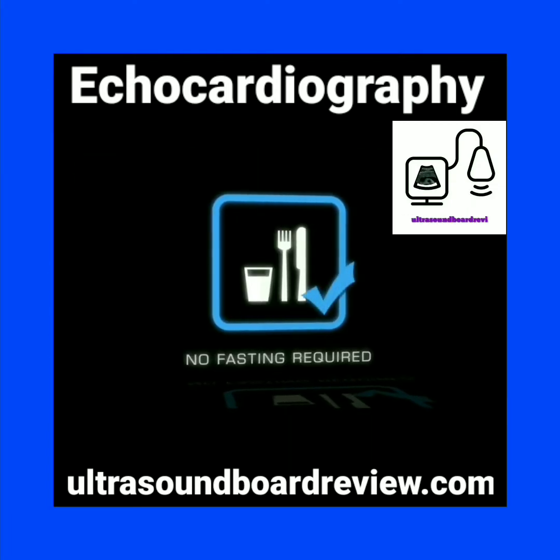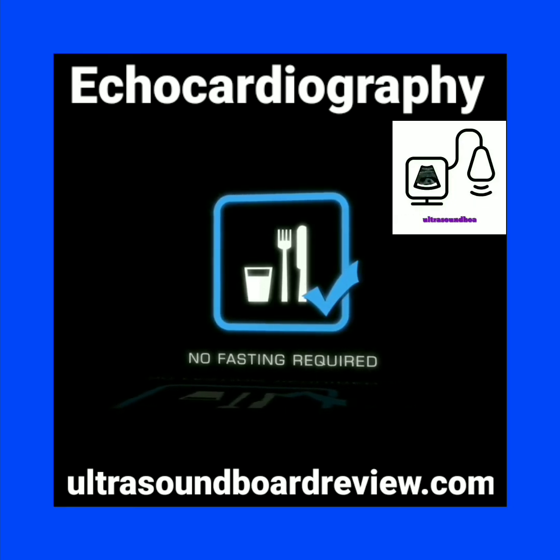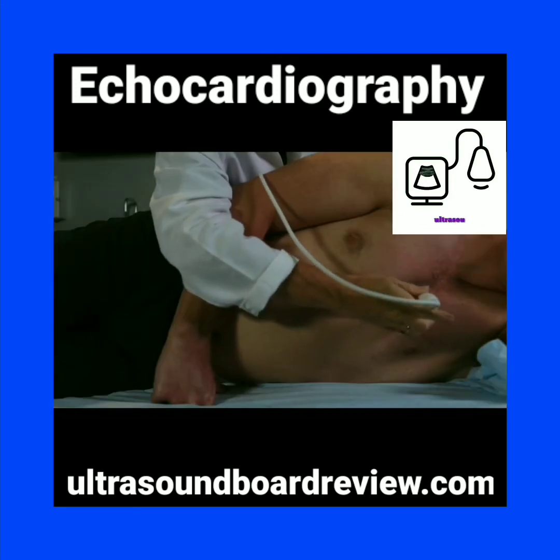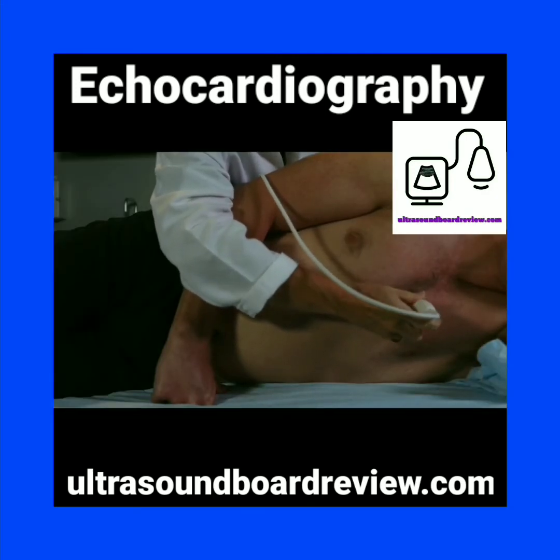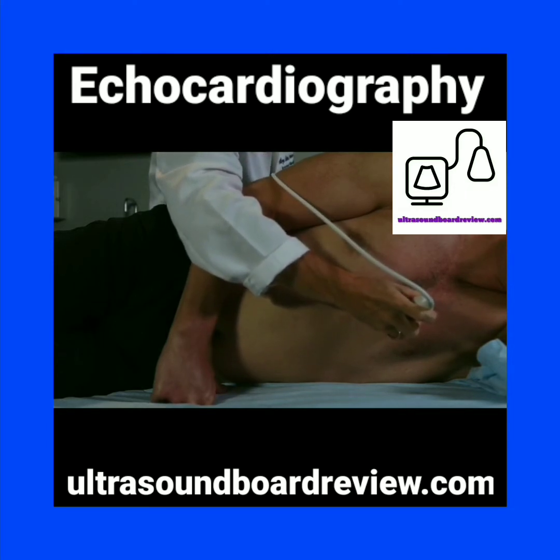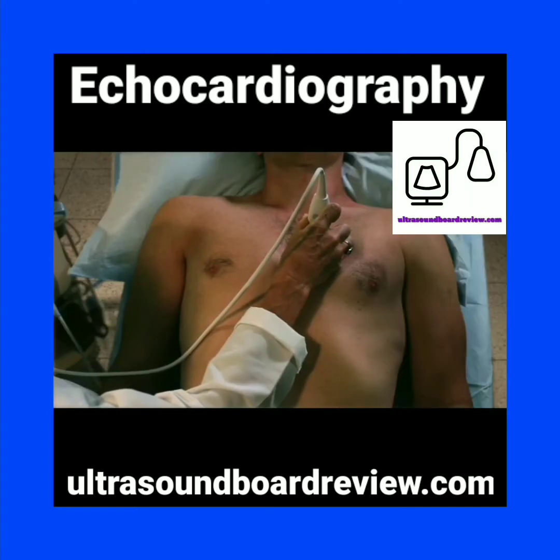There is no specific preparation needed for transthoracic echocardiography. The patient does not need to fast for this exam. Ideally, the patient should lie in the left lateral decubitus position when parasternal and apical images are being obtained. However, the patient can be scanned in the supine position if the patient is unable to roll over.